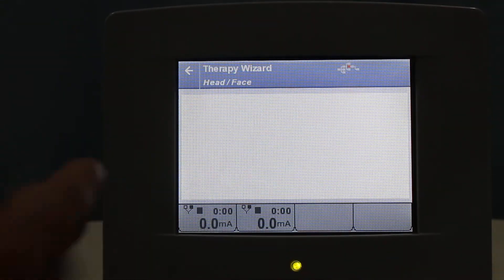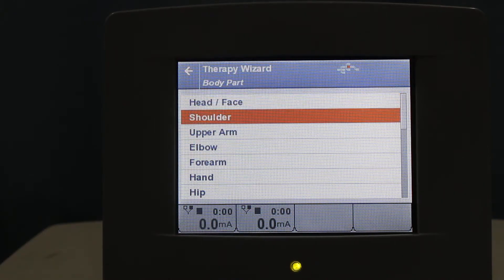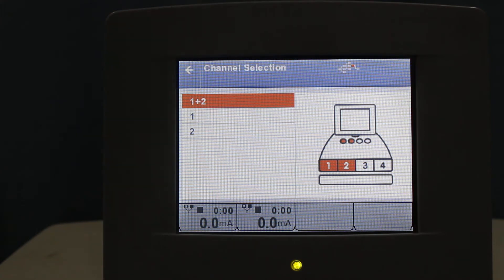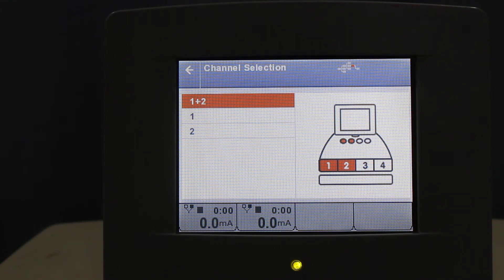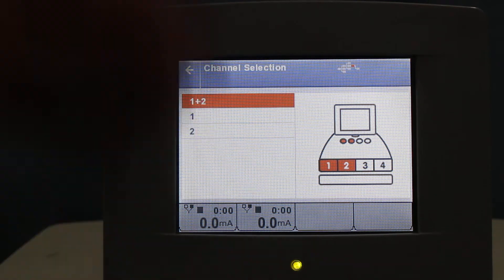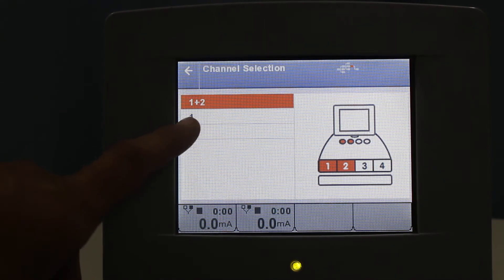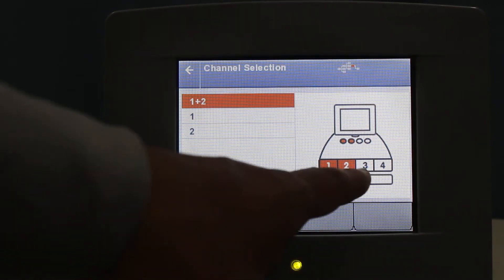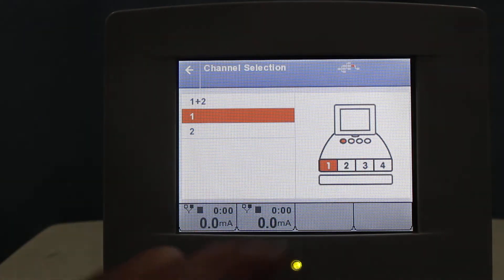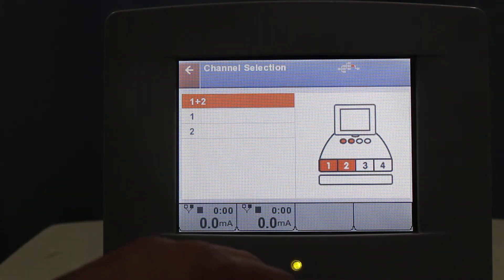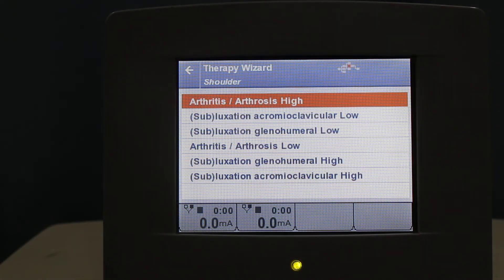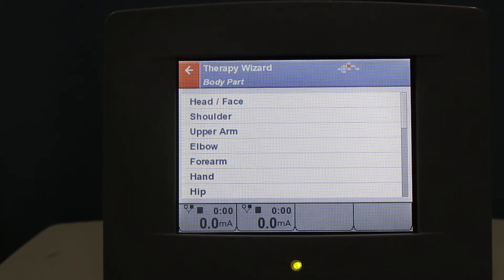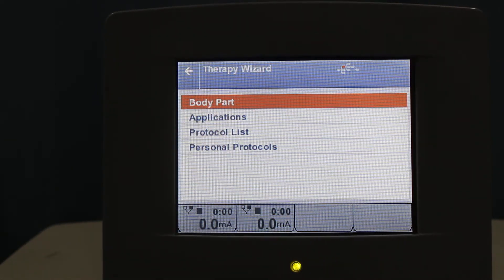For the body part, you can choose the head, face, shoulder, arm, or any other option. There is no program for head and face, so we'll go back. Let's click shoulder — for arthritis or arthrosis, it gives you the option to use either a single channel or two channels. If you select both channels it will use both; selecting one or two will use that specific channel. You can select any number of channels available.